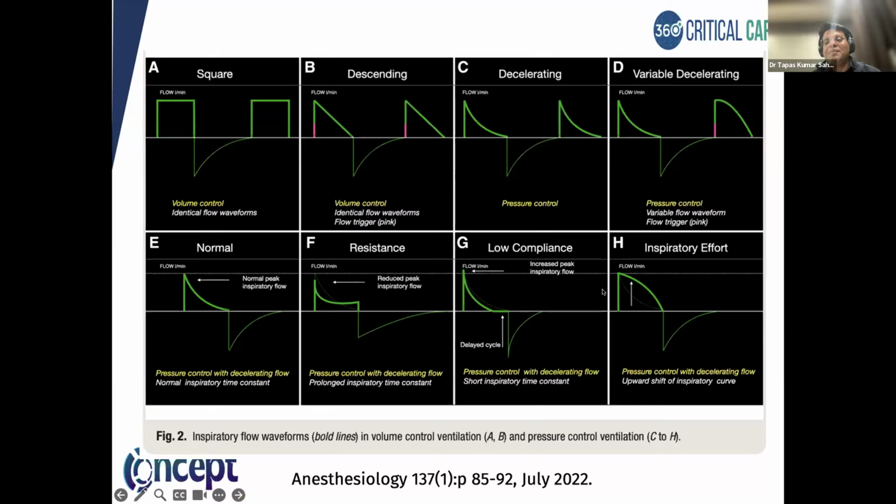Then the inspiratory effort. The patient is trying to actually take so much of inspiration here. Upward shift of the inspiratory curve. Okay. It would look like a little bit swollen.